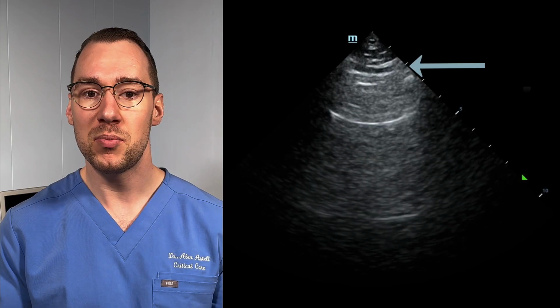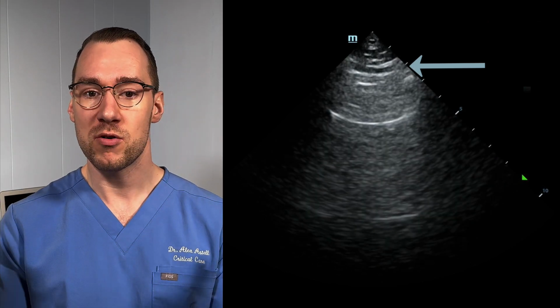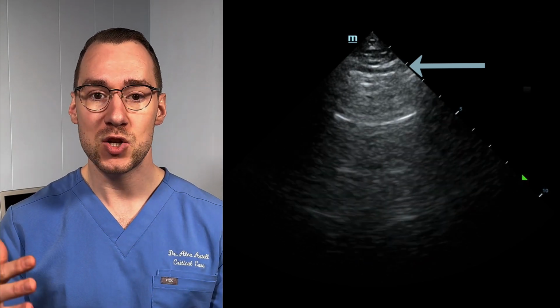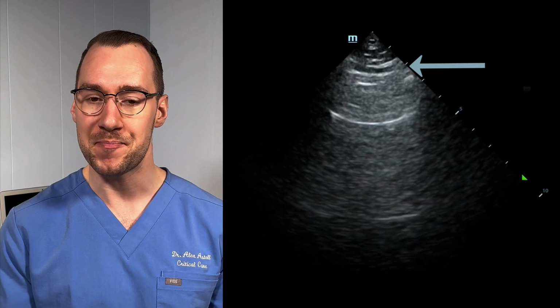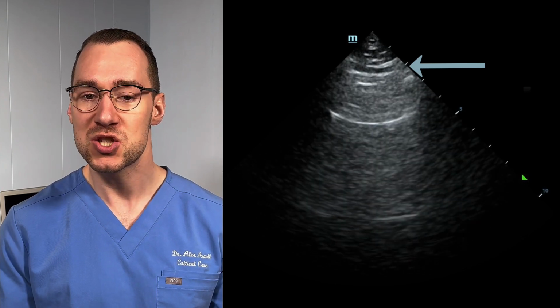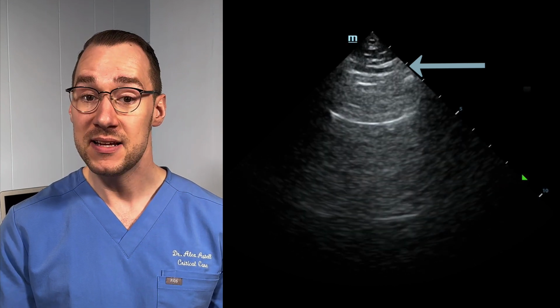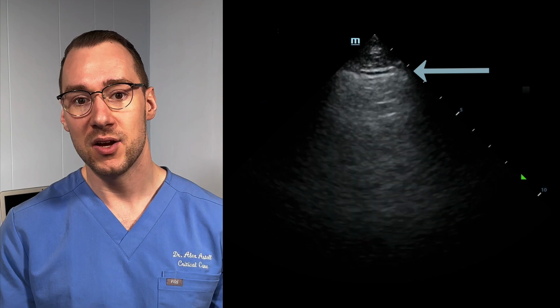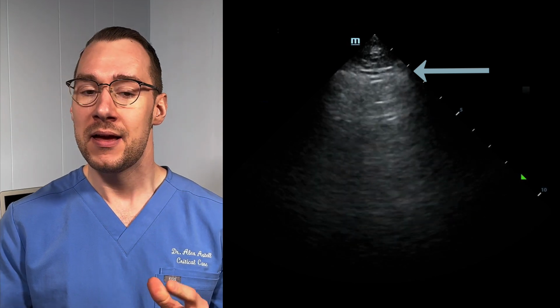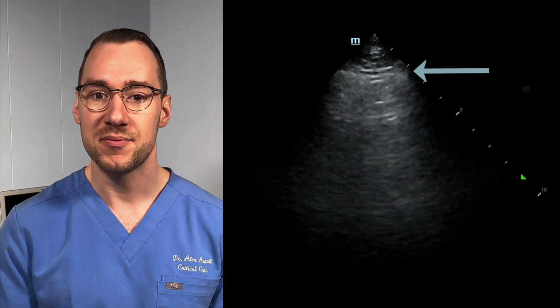Here's an example of a pleural line without sliding. Here we see the bright horizontal pleural line as we expect, but no movement or shimmering with time. This patient was being ventilated while I captured the image, so I would have expected to see sliding. In fact, this is what the left side looked like, with sliding. This patient had a pneumothorax on the right side that explained the lack of lung sliding.